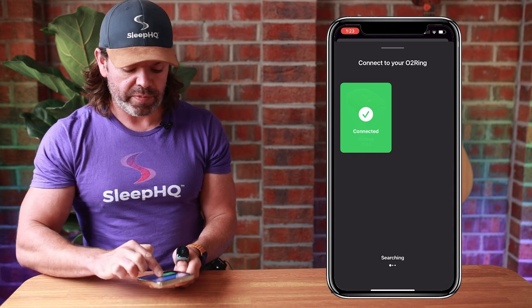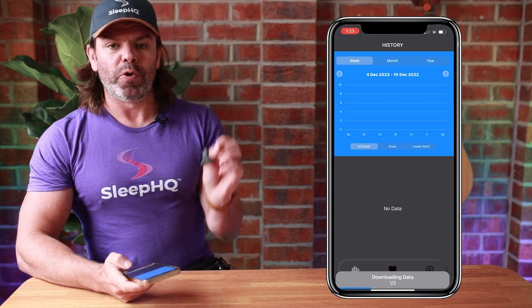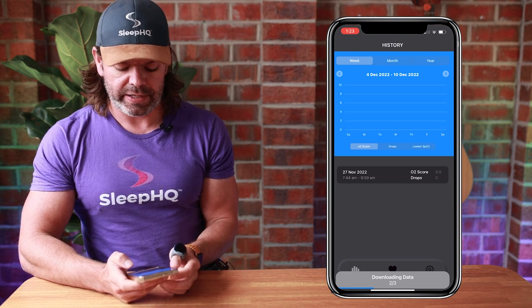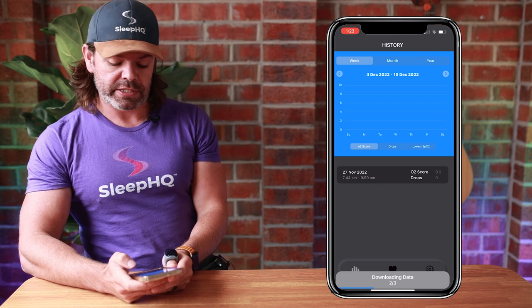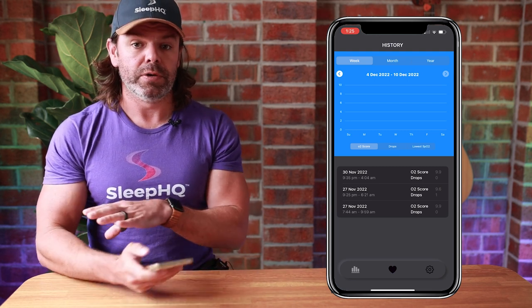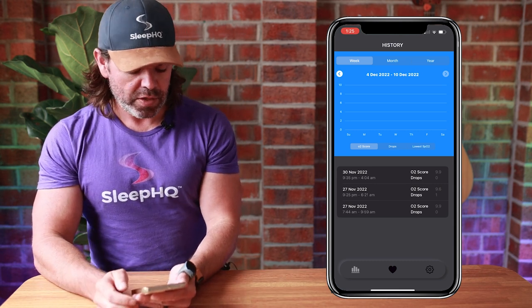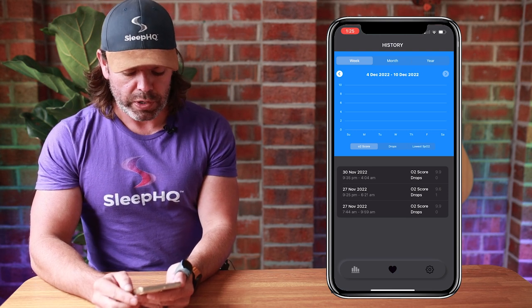Just swipe down from the top. Because my ring already has some data stored on it, it will load that into the app — it's downloading two of three nights right now. We're on the history tab, where you can view your O2, pulse rate, and movement data directly inside the SleepO2 app, which is completely free. I've got files here from the 30th of November 2022 and the 27th of November.